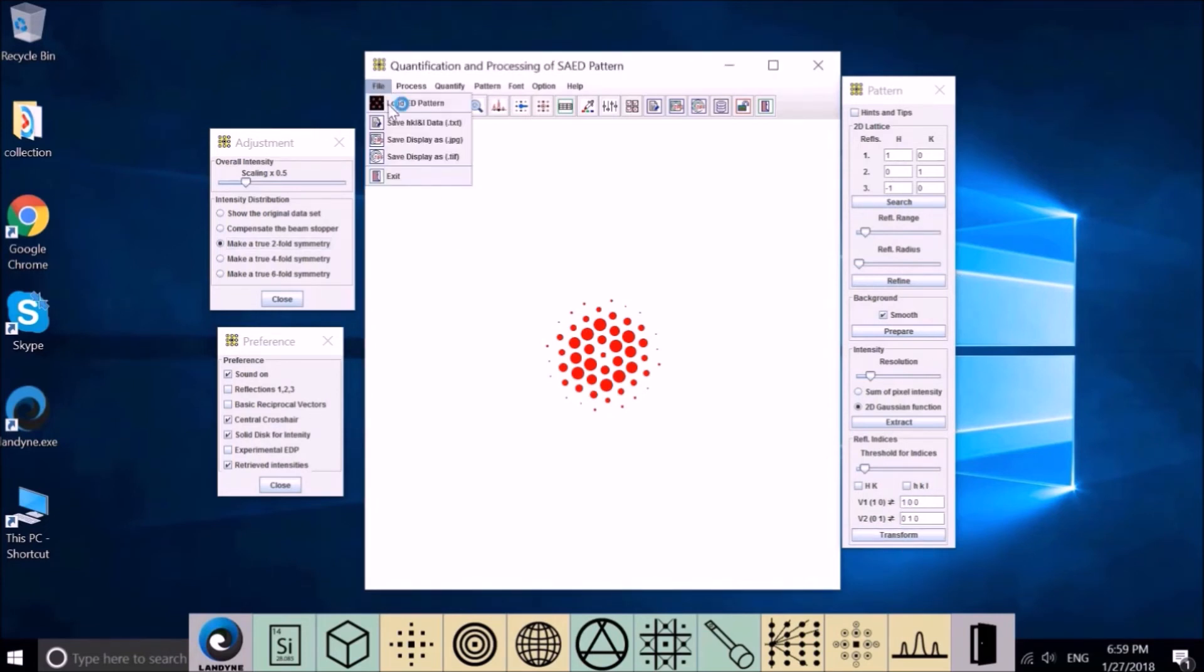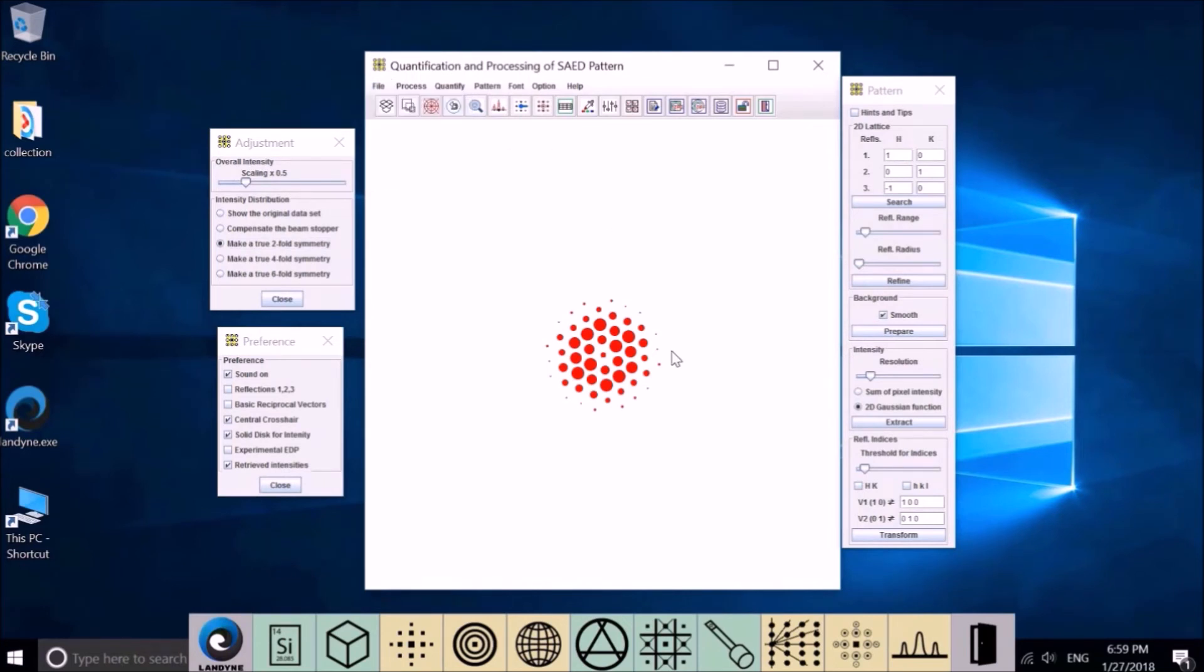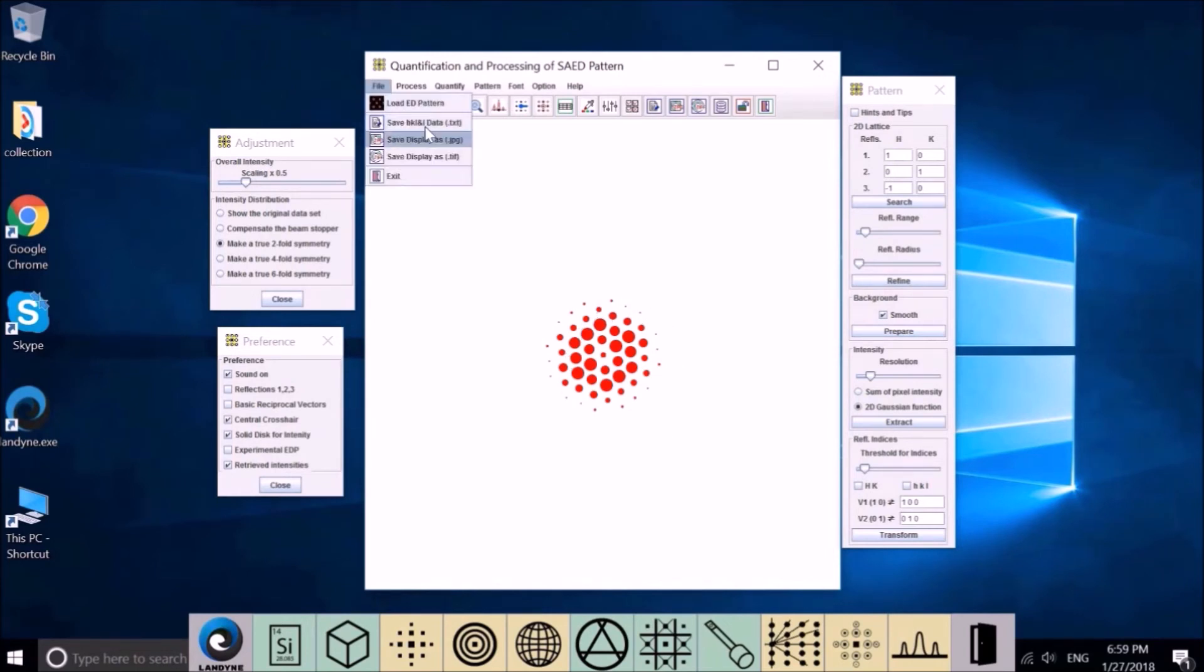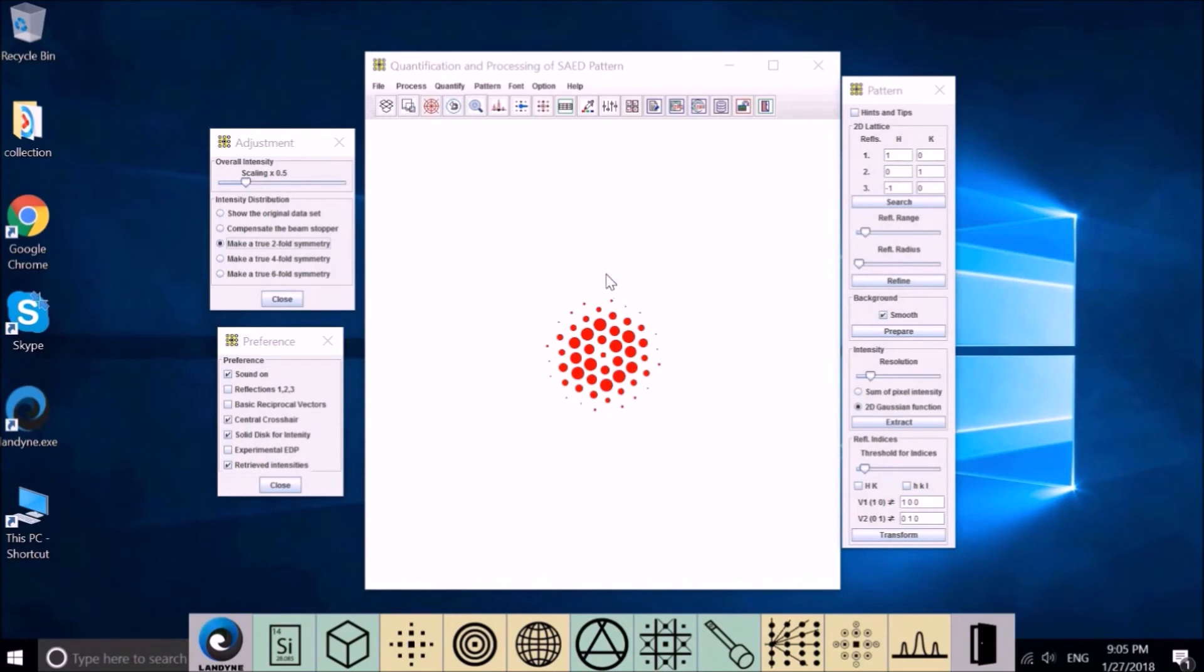Click here. You get the HKL intensity file with a true index there. Then you can save here HKL intensity. Depending on whether you choose either original retrieved data or processed data, you can save here the current intensity.